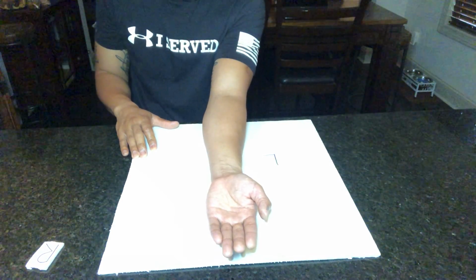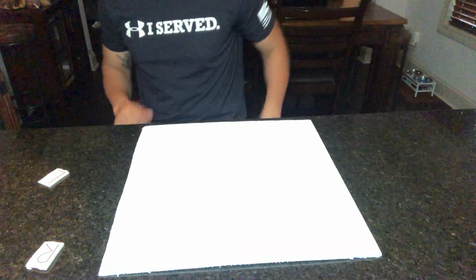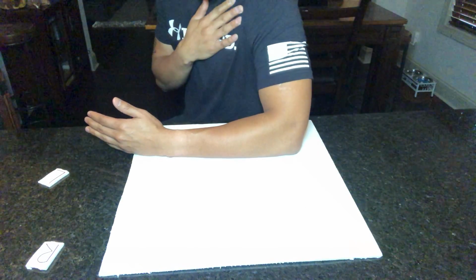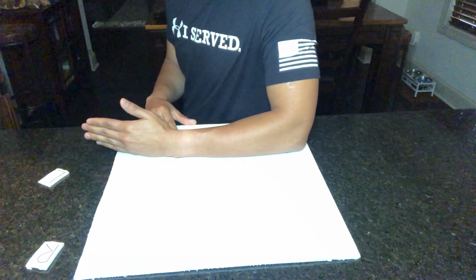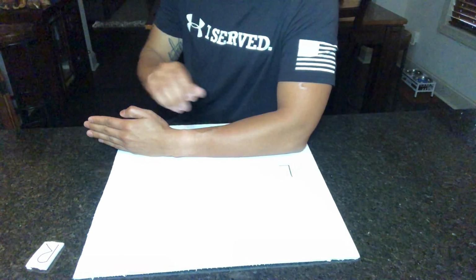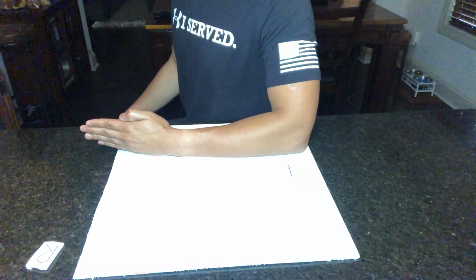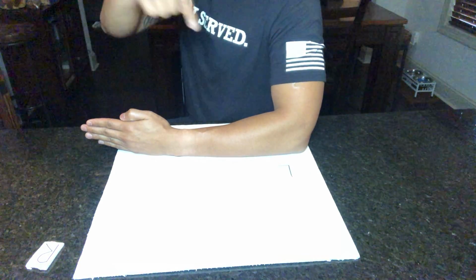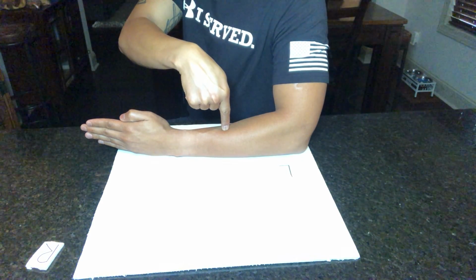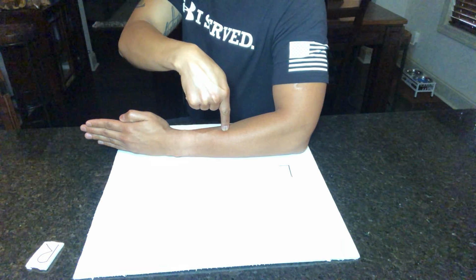Lateral forearm, it's going to be a little bit different. So we're going to have the patient shift over, shoulder, forearm's actually going to be parallel with the table. Left here, marker, 40 SID, cassette 10 by 12. Central ray is going to be perpendicular to the midpoint of the film. And what we're looking at here is the radius, ulna, distal humerus, proximal row of carpals.